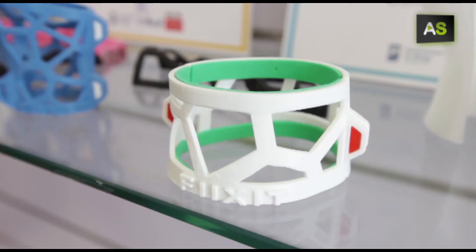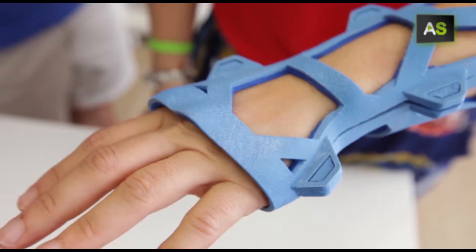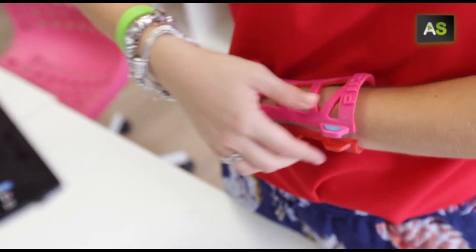Using 3D printing to create an alternative to plaster casts is the project of a group of young entrepreneurs from Málaga who, with the initiative Fiixit, are improving the day-to-day lives of patients with broken or fractured limbs.